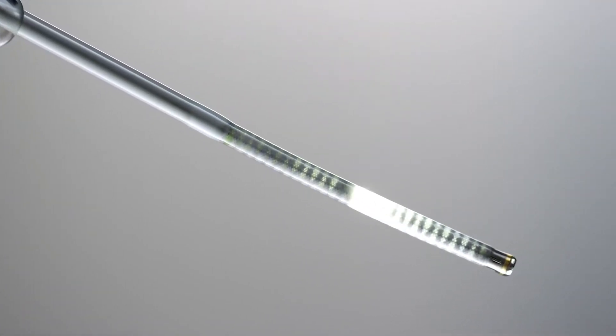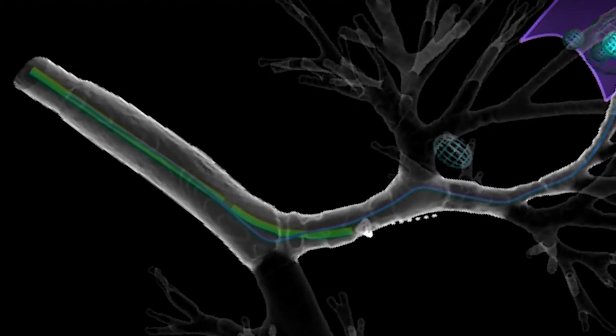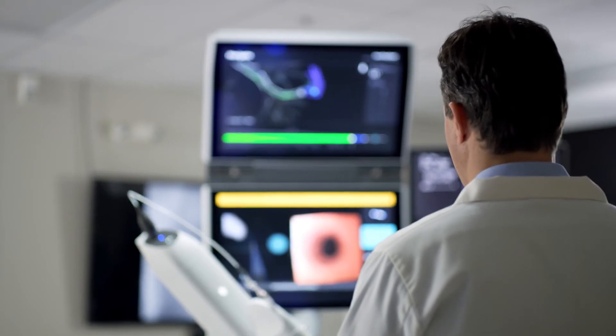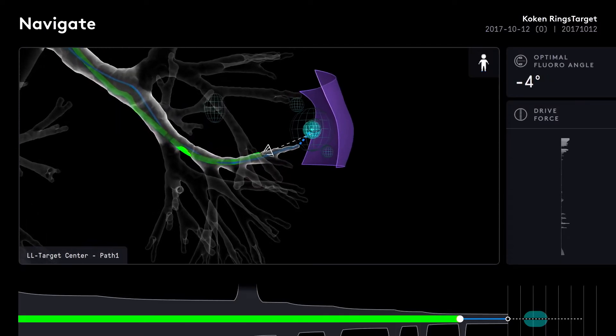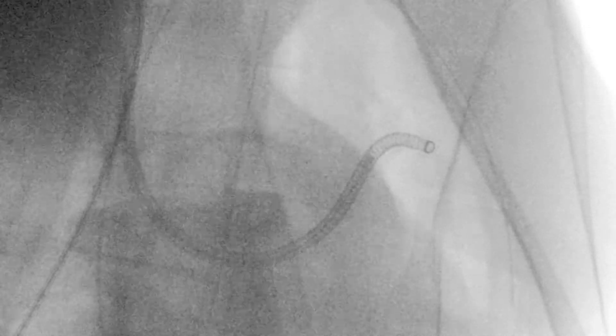IRON's shape sensor provides precise positioning and orientation information. This enables precise control of catheter positioning and interaction between the biopsy tool, tissue, and the catheter itself.